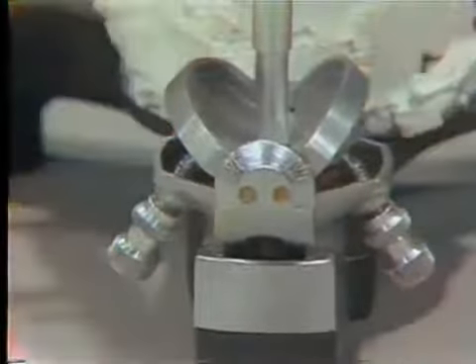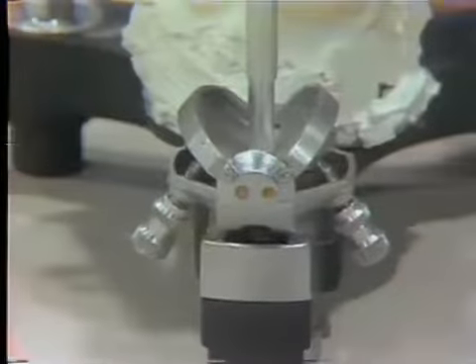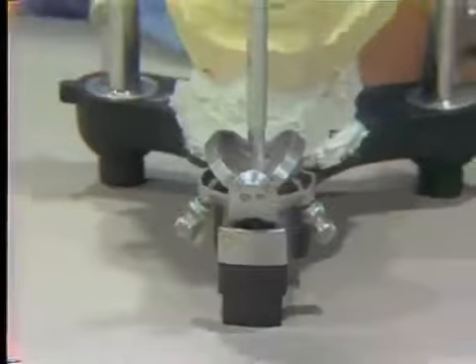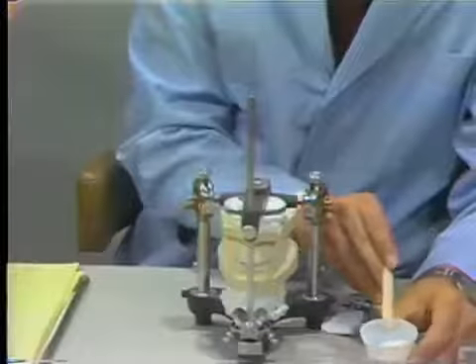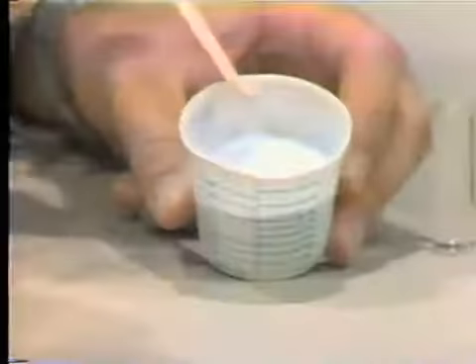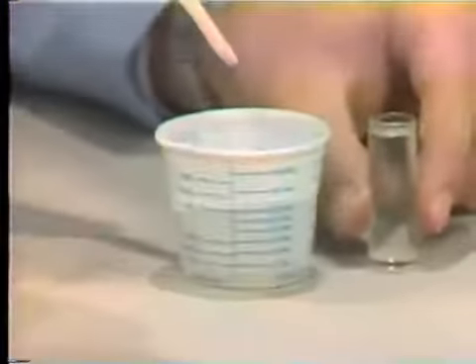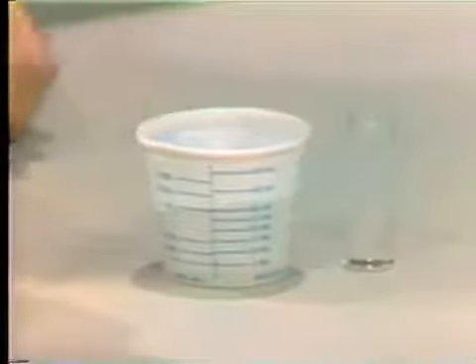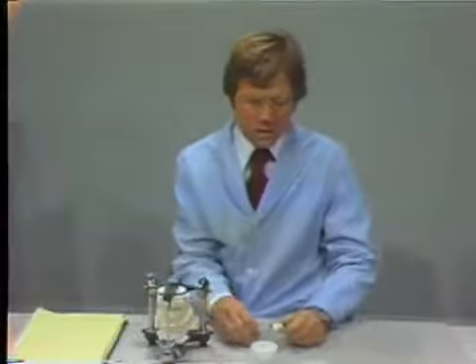The next thing I do is to measure out my autopolymerizing acrylic or quick cure acrylic. Here we have a fast setting acrylic. This is the powder and this is the liquid, which comes with a measuring device which you should use in order to get the proper consistency.